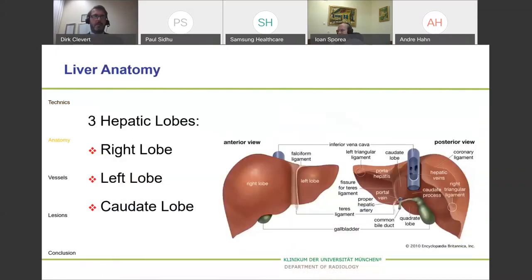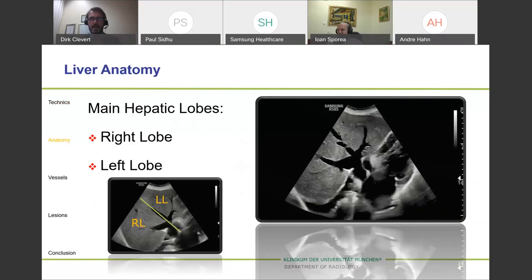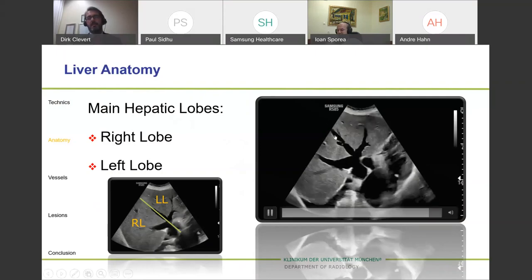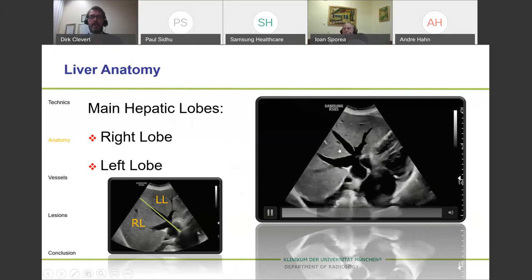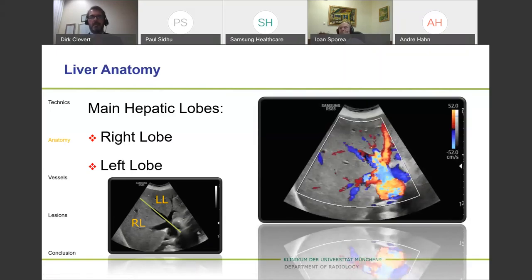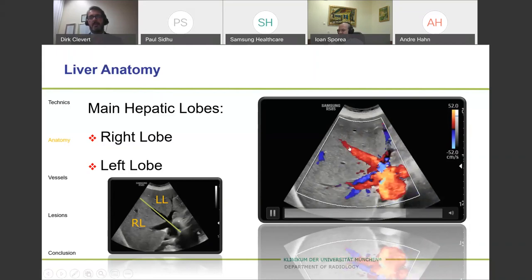When speaking about liver anatomy, the main topics include three major lobes: the right lobe, the left lobe, and the very small caudate lobe. The middle liver vein divides the liver into the left liver lobe and the right liver lobe — that's an easy reference. If you want to confirm which is the liver vein, you can use color Doppler to see the left, middle, and right liver veins.